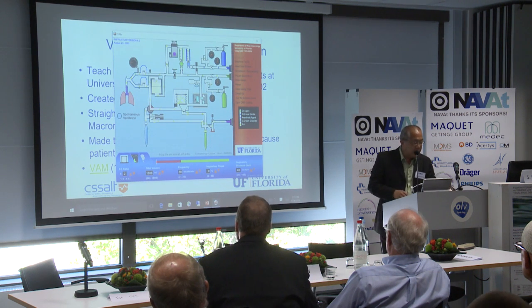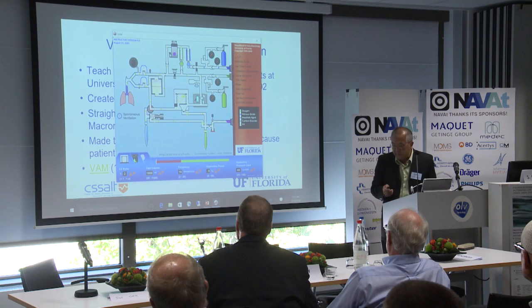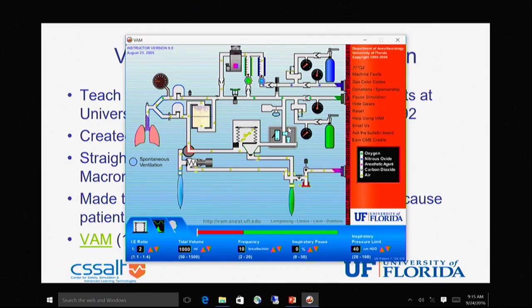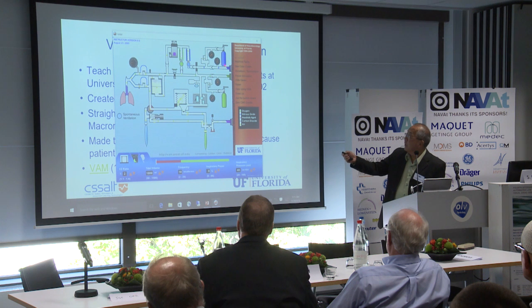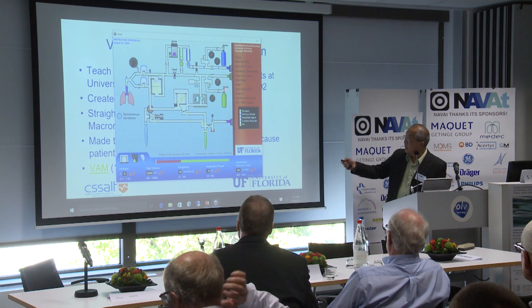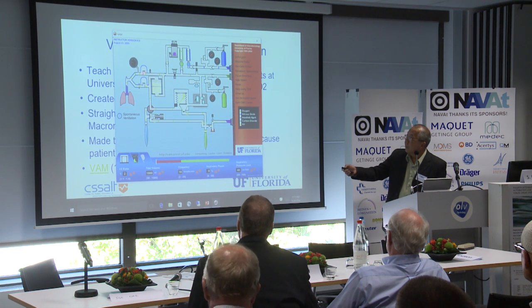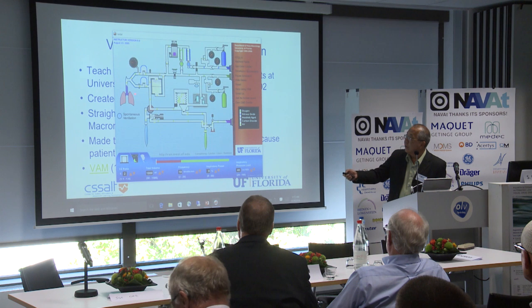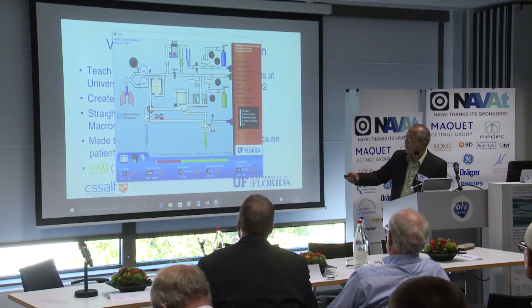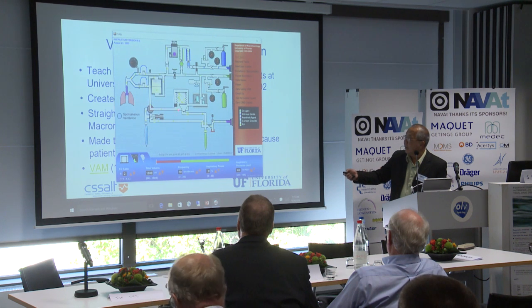This is the virtual anesthesia machine — it's online. I'll walk you through it. This is your oxygen pipeline, oxygen flush valve, oxygen flow meter knob, nitrous, the tanks. The color code is for the US — I can change that. Vaporizer, CO2 absorber, inspiratory valve, airway pressure gauge, the lungs, expiratory valve, selector knob, manual system, pop-off valve, APL valve, bellows, ventilator, and scavenging system. Everything is interactive, so I'll do a quick demo.